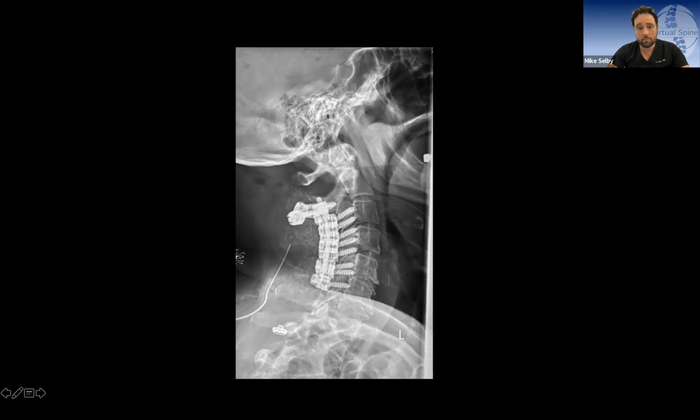Yeah, I go back and forth, to be honest with you. I'm a big fan of the pedicle screws, but if I have a resident that says, I've never done any translaminar screws, I'm like, all right, let's throw some translaminar screws. I'm not a big fan of it for deformities, but for a case like this, where things are going to remain relatively static, there's not huge biomechanical forces. We haven't done any osteotomies, corpectomy, what have you. I do think it's probably okay to end with these.